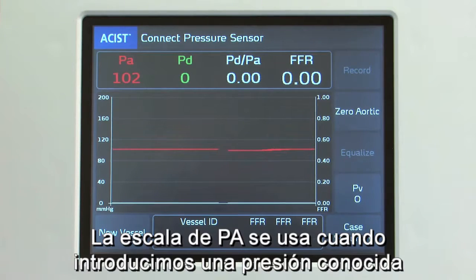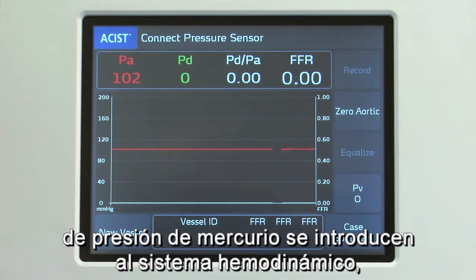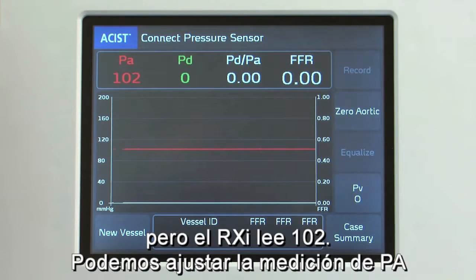PA Scaling is used when we input a known pressure into the hemodynamic system. In this case, 100 millimeters of mercury pressure is input into the hemodynamic system, but the RXi is reading 102.